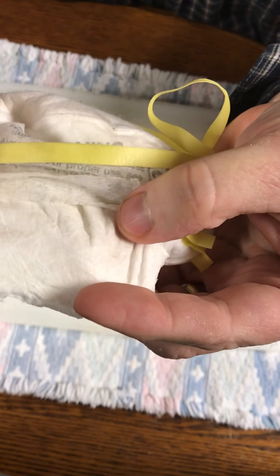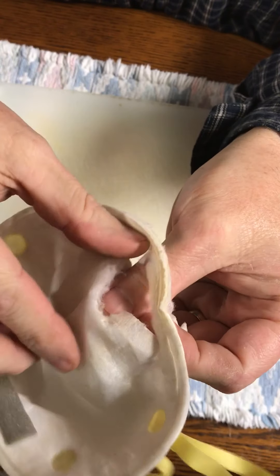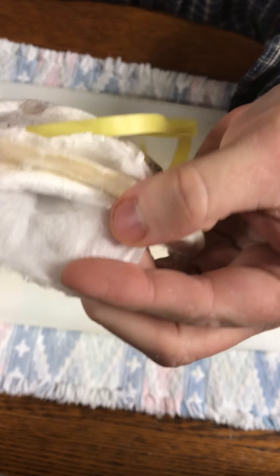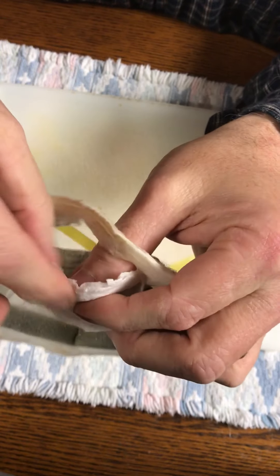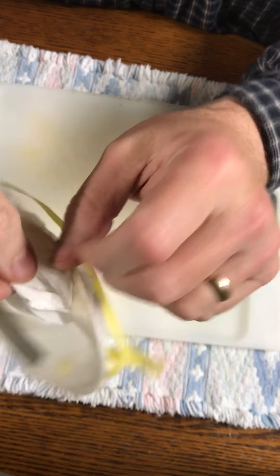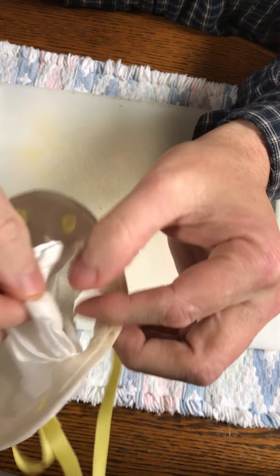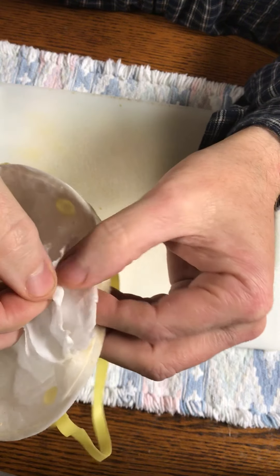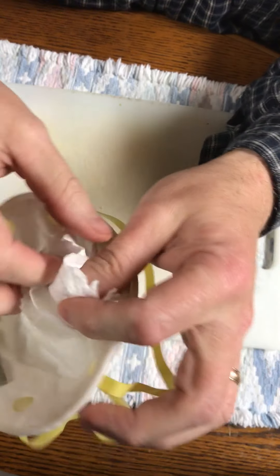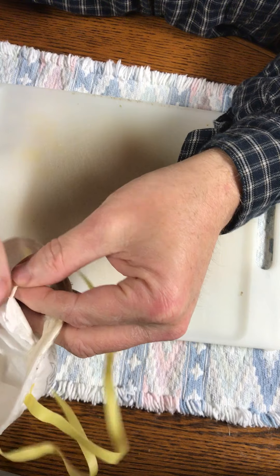I'll zoom in - the outside layer here, and then the middle layer. Actually, I think the middle layer is two separate layers - yeah, they pull apart easily. So there are actually four layers, but the middle layer is the same material just doubled.